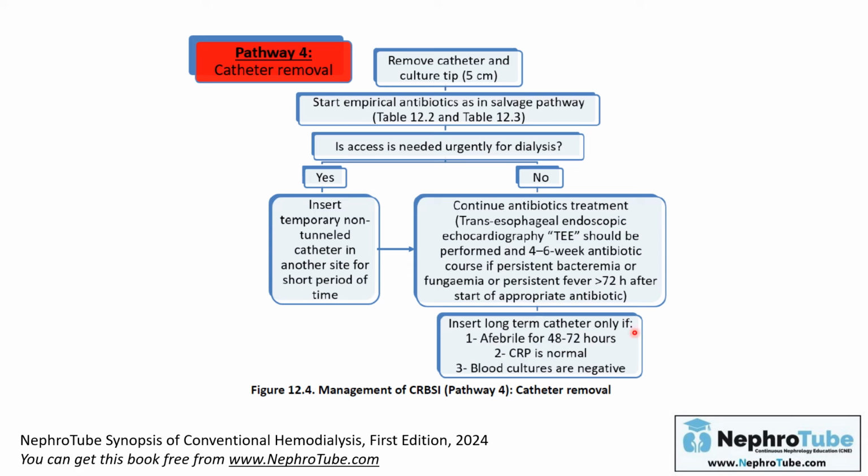When to reinsert a long-term catheter in the patients? You have to reinsert catheters only if the patient is afebrile for 48 to 72 hours and CRP is normal. But I have to stress on this point that usually in our dialysis patients, the CRP is never normal because CRP is an inflammatory marker, so it will never turn normal even in patients without infection.